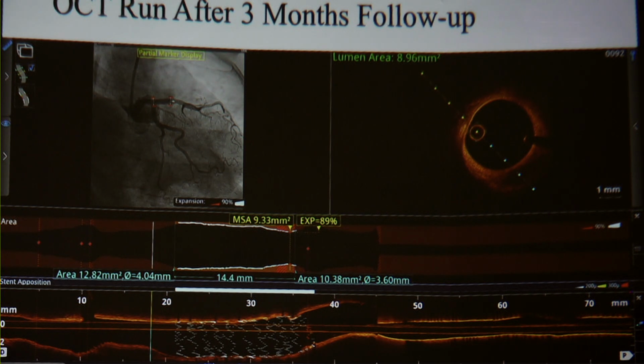Yeah, although I'm not understanding the behavior of the metal, why it would get expanded. So I noticed it just now, but again the difference is not great, 9.19 and 9.33. But again, this is how we should use imaging in our practice, I think.